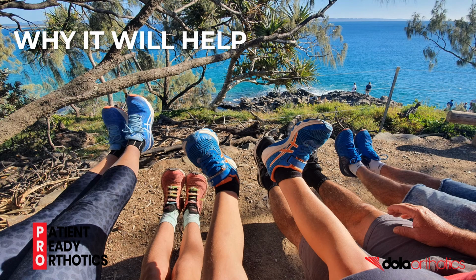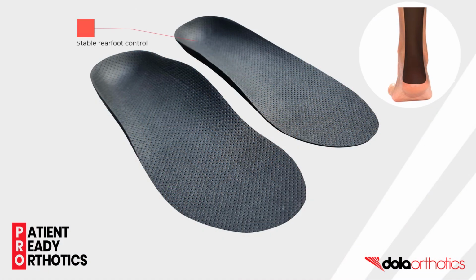So how does the patient-ready Rearfoot orthotic help my patient? This orthotic is specifically designed for patients with rearfoot or posterior leg pathologies to address the most common pathomechanical causes. Stable rearfoot control. The rearfoot platform provides stability for the transition from heel strike to mid-stance. The medial arch support provides support for the medial arch for transition from mid-stance into propulsion. It improves the windlass activation, forefoot stability, and promotes a high gear toe-off.